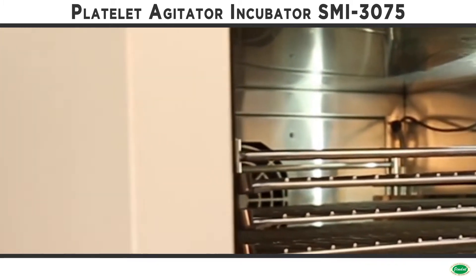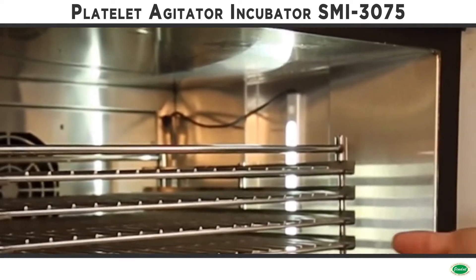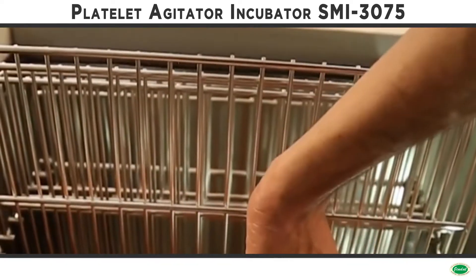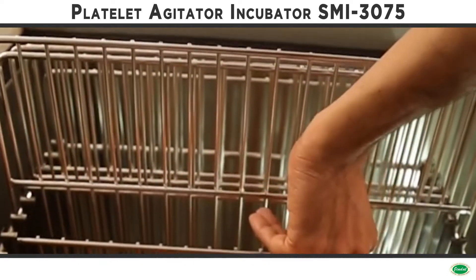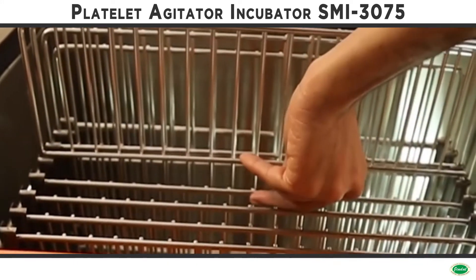It is preset at 22 degrees Celsius for platelet application. The inner chamber of the incubator and the agitator shelves are made of stainless steel, and the outer body is made of mild steel, duly powder coated.